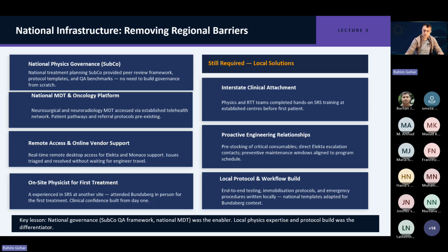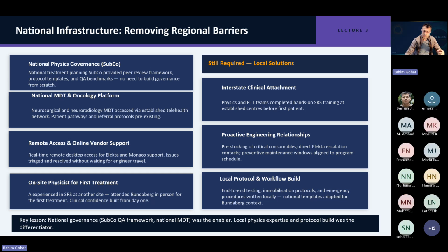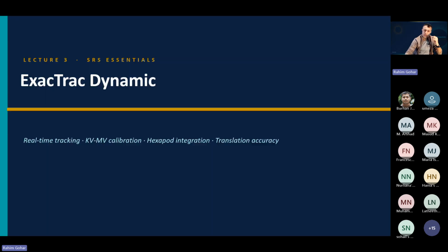Because if you don't have a properly established multidisciplinary program, if you don't have a credentialed RO to discuss an SRS plan, right, how are you going to proceed with the treatment? So these are some of the challenges. And if you don't have physics access, if you don't have access to the built-in protocols and departmental policies, then you need to do everything from scratch. That was not the case in our case, so that was easy for us.